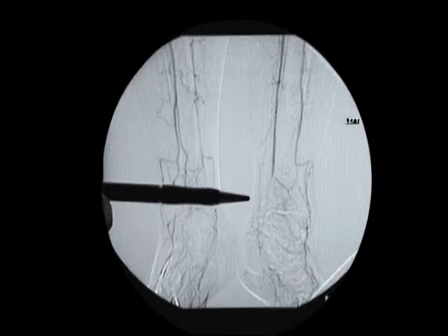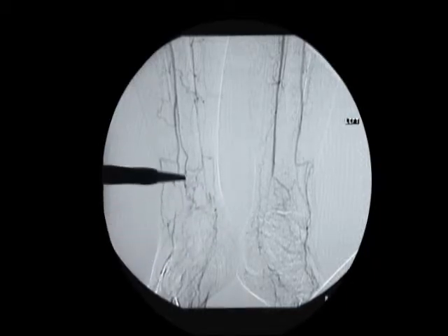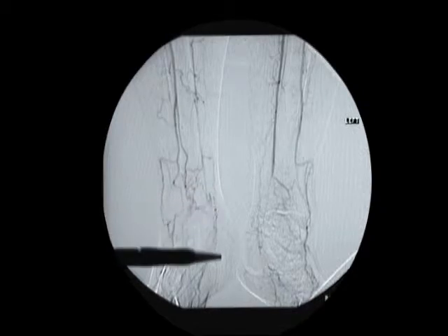level of the ankle, concentration will be paid on distributing the bulk of the injectate across the foot. We'll start within a centimeter of the termination of the branches of the peroneal artery and extend densely over the dorsalis pedis distribution as well as over the posterior tibial artery distribution.